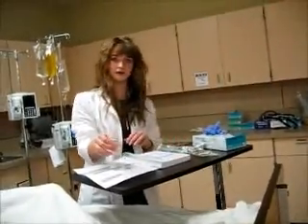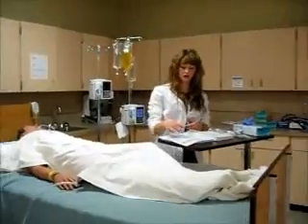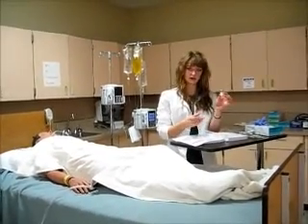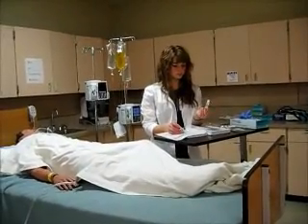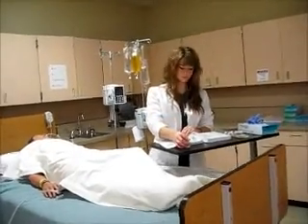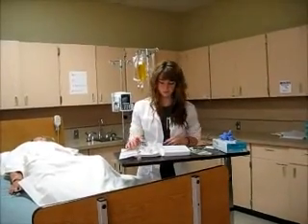So I'm going to again check my MAR, check everything that I have, and I'm going to push my curtain over to make sure that I have privacy for my patient. I brought my vial in so that I can do my other check for insulin. And here is 5 milliliters, and that's what I've diluted my insulin in. So I have 8 units in there. I have my 2 flushes and my infusion.